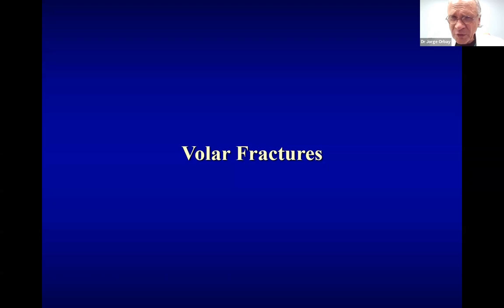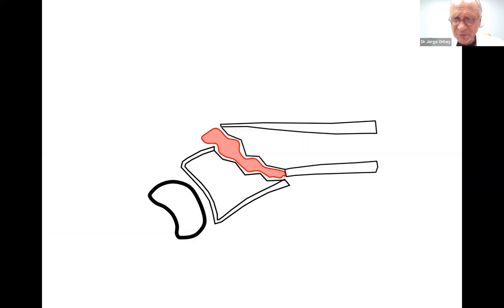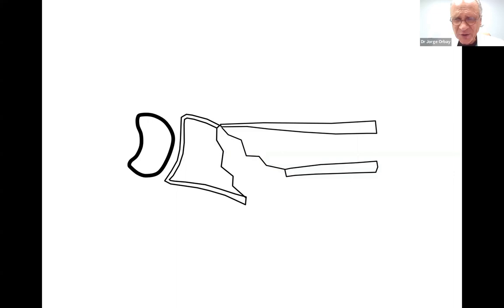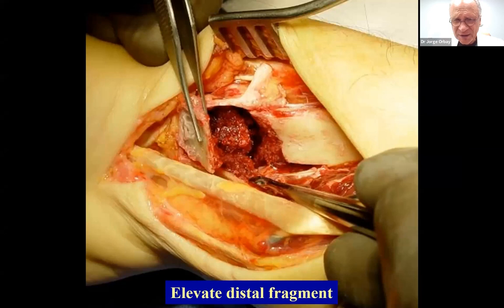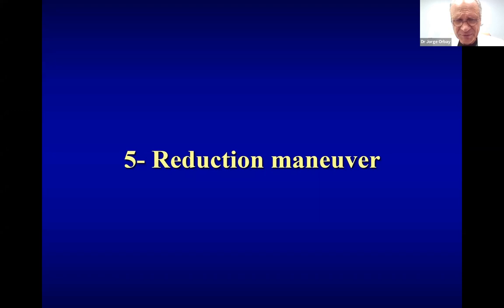I find volar fractures — the ones we were treating with plates when I was a resident — to be the most difficult ones, because I cannot pronate the proximal fragment out of the way; the obliquity is wrong. In these cases the approach is different: we have to lift the distal fragment up and evacuate the hematoma to get the reduction. That volar thin cortex often breaks when you lift it up, and many times you have to work inside the joint from that volar approach. It is totally possible, but it's more difficult than dorsal fractures.